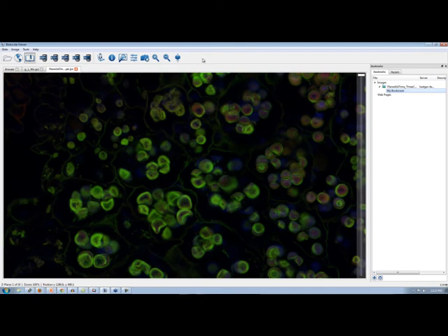That's so cool. And when you first showed me this, I immediately thought of an application where I felt this would have been very useful. I can imagine a situation where you have an offsite colleague generating virtual tissue, uploading it up to Biolucida Viewer. Now, one of my lab mates can sit at a workstation in our lab and load this up. And let's say I could tell them to go through and survey the entire hippocampus and find cells of a specific morphology.